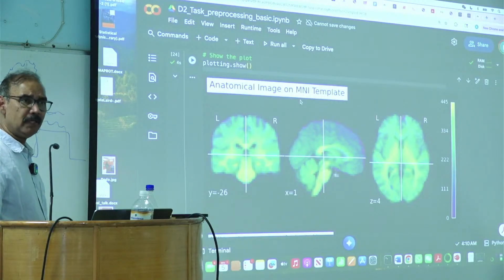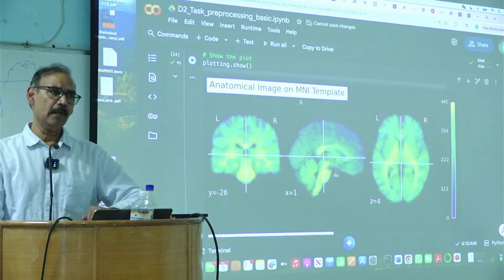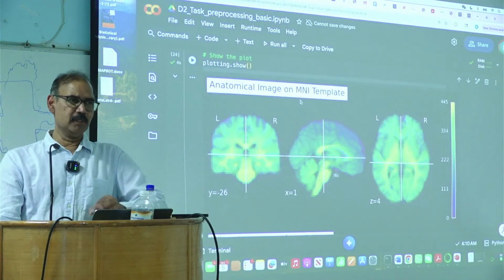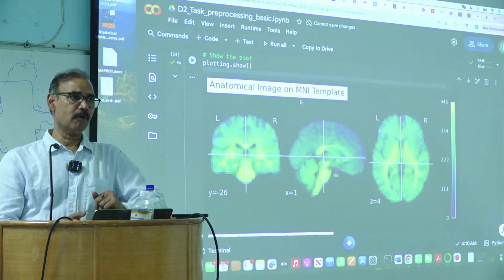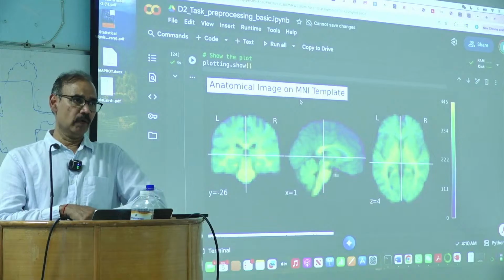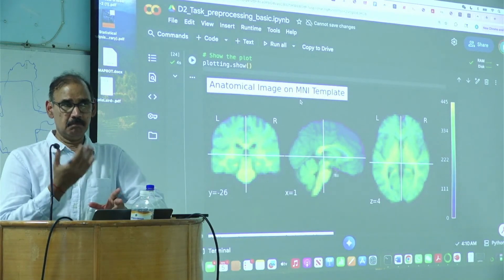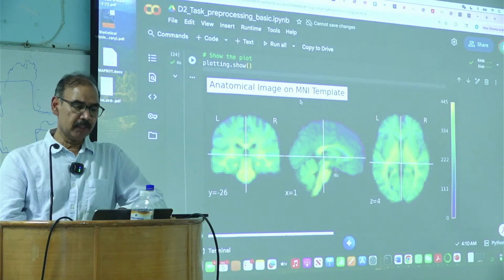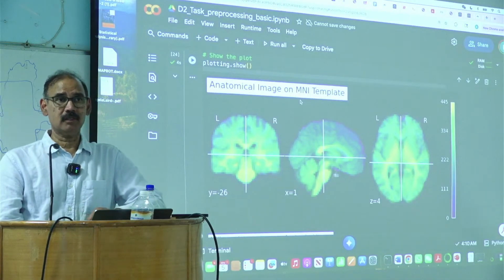Right. So if I understand you correctly, what you're saying is that, let's say this was done using Caucasian brains, maybe using people from India, the template may not be the best one to use, right? Or if you were to scan 100 people in Japan, maybe this is not the best template. But that's a very good point. Are there any other limitations?